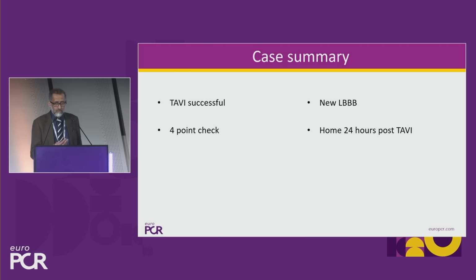If we send them out, then we're planning to try and get home the same day if the bundle recovered. Then they get another 4-point check pretty much every hour, not an echo every hour. They'll get one echo before they go home. But the 4-point check is something that I've trained all of the juniors, all the nursing staff to do: ECG check, echo check, leg check, and a stroke check.